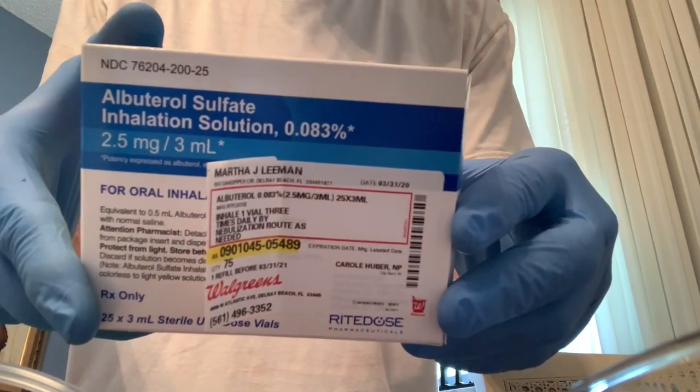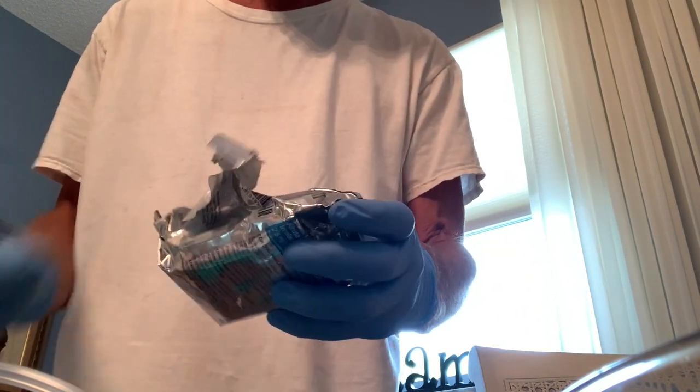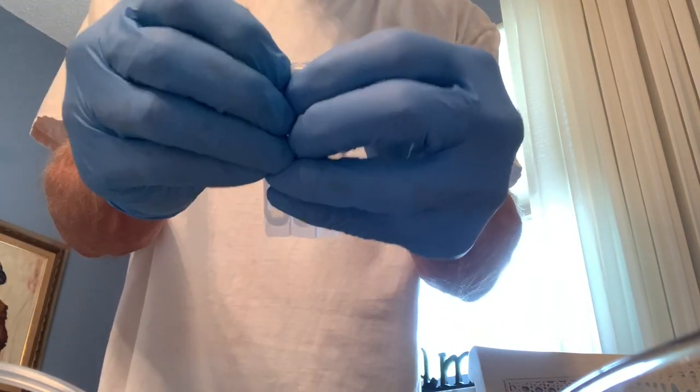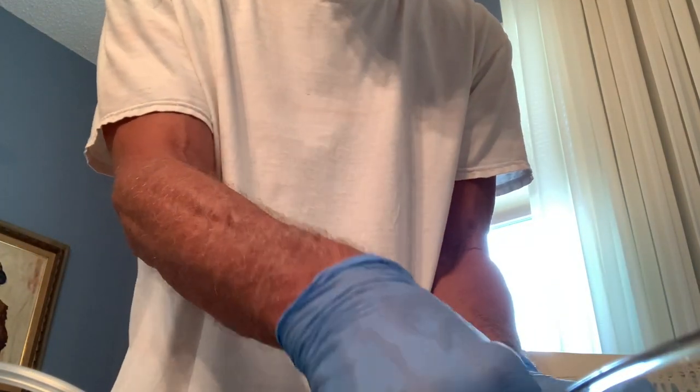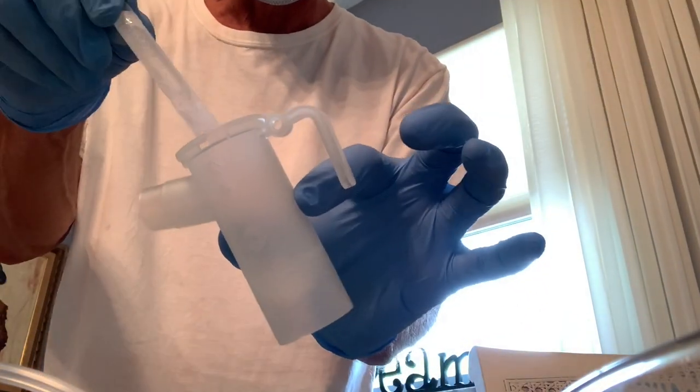This is the drug that we're going to inhale. It comes in those packets — they look like this, as you can see. You've got to break one off; it just kind of pops off like that.